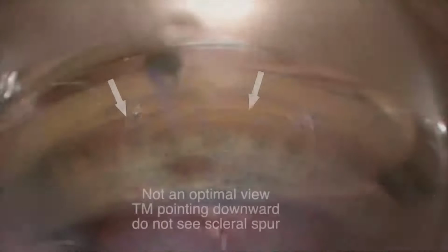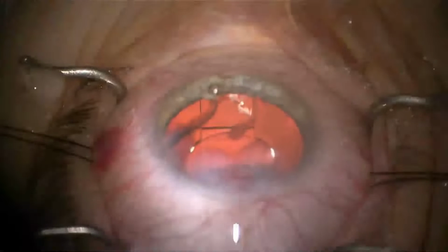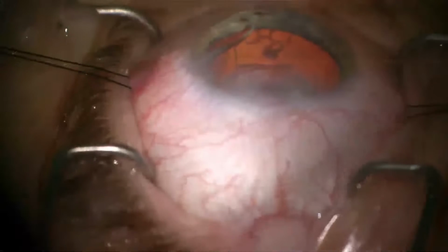As I zoom in, I can see the trabecular meshwork here, but it doesn't appear that the trabecular meshwork is pointing at me like an en-face view. It almost appears that the TM is pointed downward. And so I'm going to rotate it just a little bit more and then also rotate the scope a little bit more as well nasally. And now you can see what kind of a view I get.